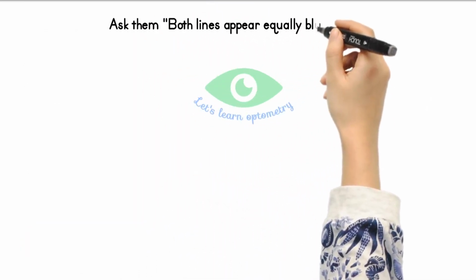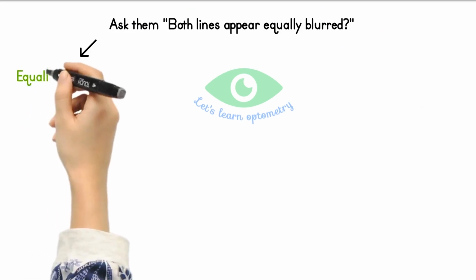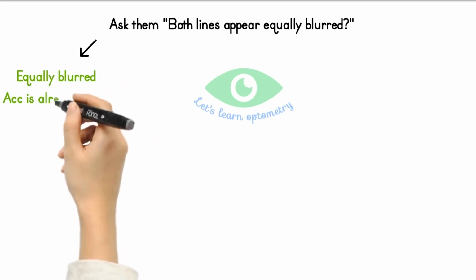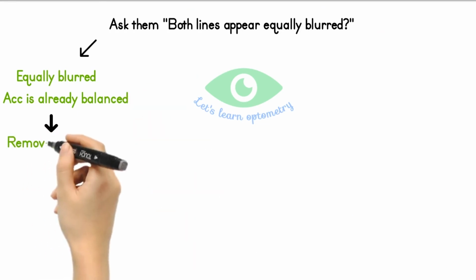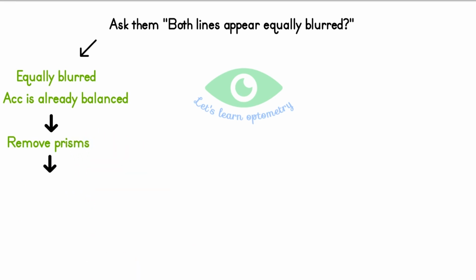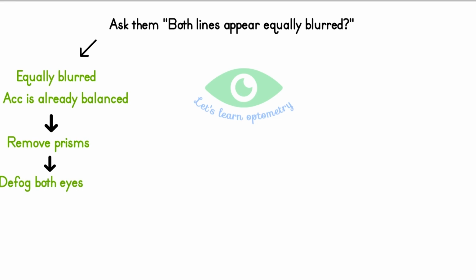If they are seeing 2 lines, ask them whether the letters in the top and bottom lines appear equally blurred. If they say equally blurred, the accommodation is already balanced. Now ask the patient to close the eyes and remove the prisms. Now defog both eyes in 0.25 steps until you achieve their initial BCVA.